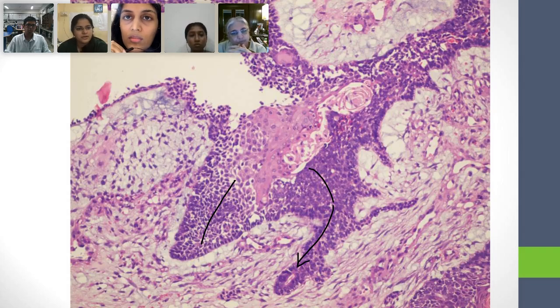Squamous epithelium. So now this is a squamous epithelium, according to you. And in this squamous epithelium, you are seeing dysplasia. That's what you're saying, right? We just said that this was, you yourself said basaloid. And so this is basaloid, and you are expecting that this is a dysplastic epithelium. That's why it's looking basaloid.